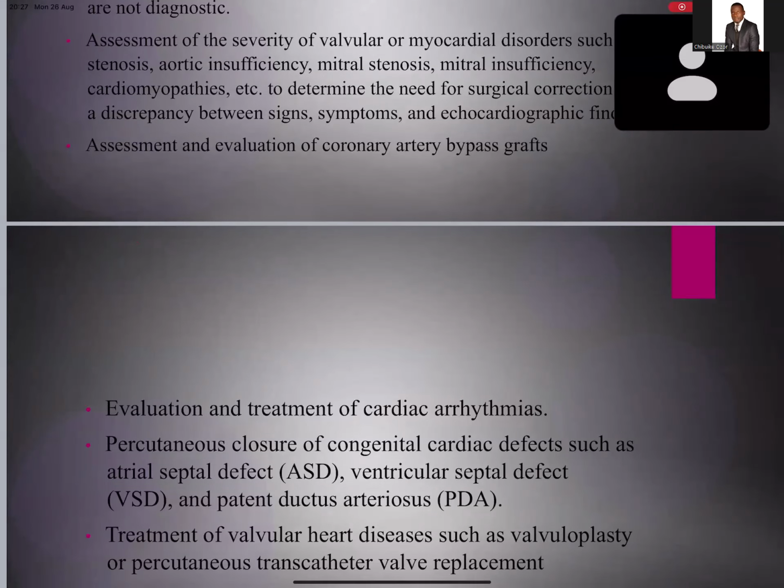That's why part of the pre-op preparation is a complete evaluation of every patient. Then you also have severe coagulopathy, and then encephalopathy, significant peripheral artery disease. And then in most cases too, if a patient has a platelet count less than 35,000, you would not want to take up the patient for a cardiac catheterization procedure. Then we have some equipment, although the cardiac catheterization is done in the cath lab.